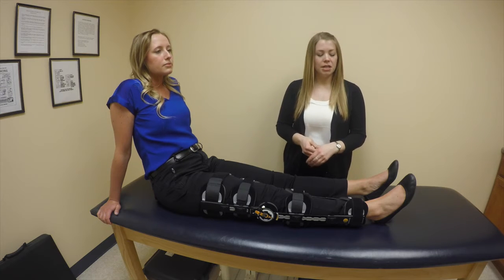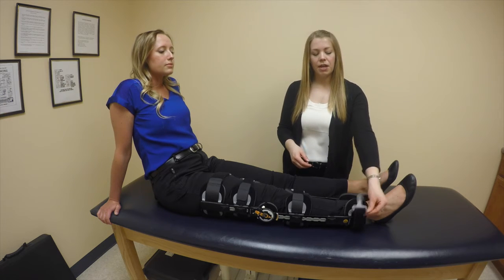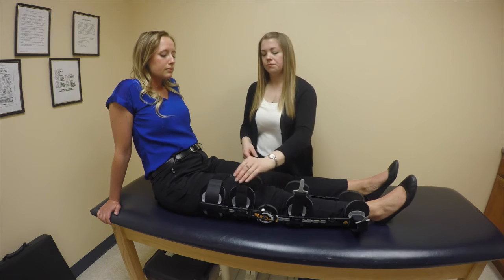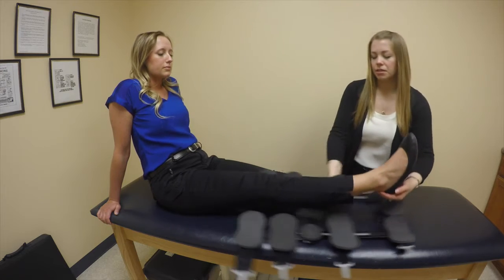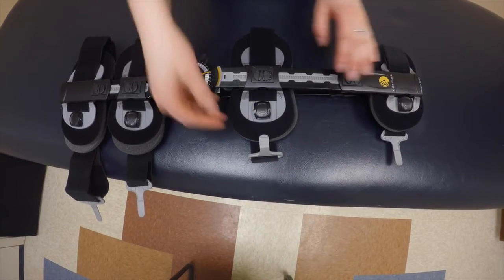When you're ready to remove the brace, you'll start by pressing each of the black buckles so that they undo on your brace. You can then slide the brace away from your leg. Here's a close-up view of the buckle.